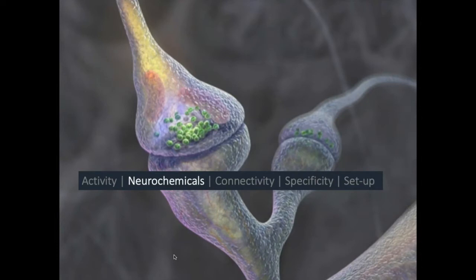That allowed us to have a hypothesis that it was primary motor cortex on the lesioned side. We then went on and did, as others have, long-term clinical studies looking at whether we can induce a behavioural improvement, having used the combination of brain stimulation and MR to determine where we think we should stimulate. Okay, that's sort of pause point one.